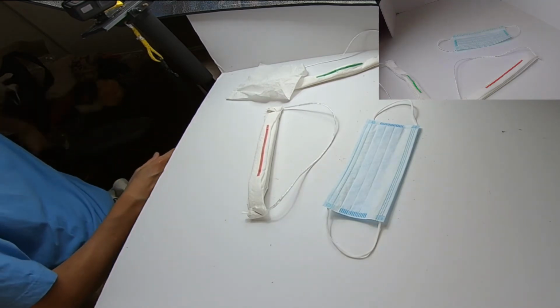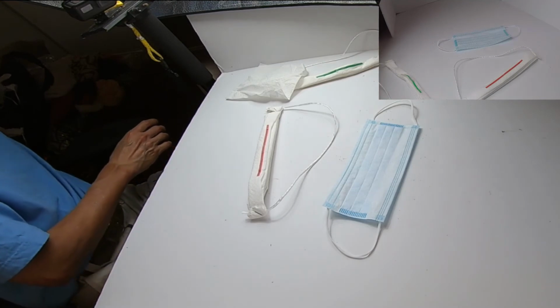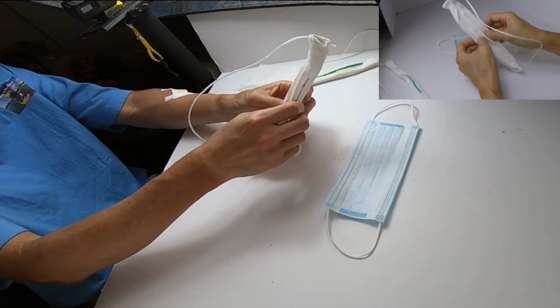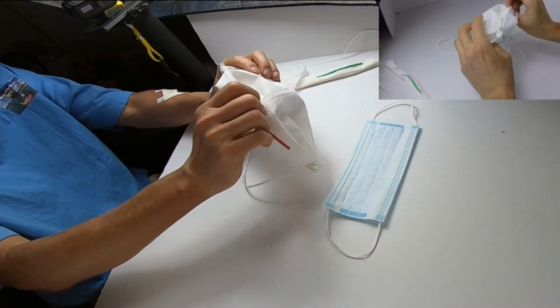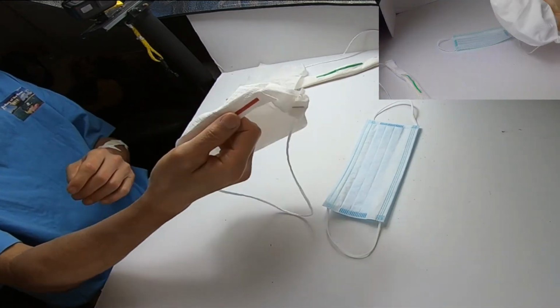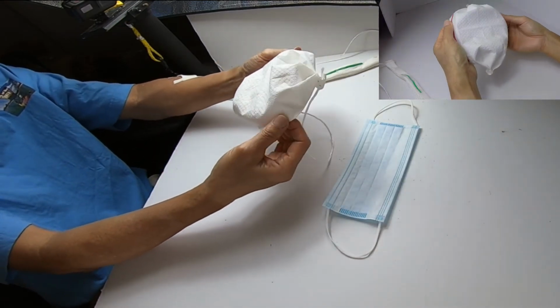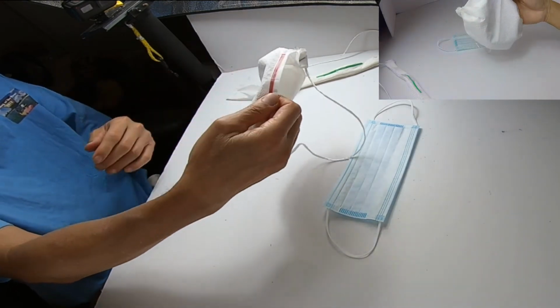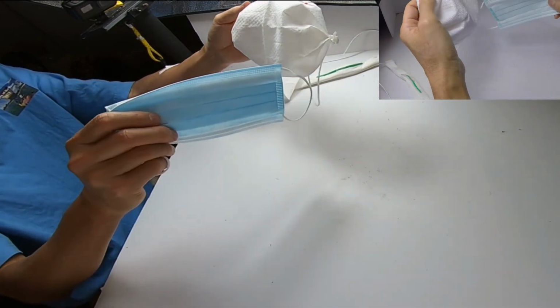So you see the finished product there, and the final step will be to open up the mask and now you have the finished mask. Now, how long did it take me to make this mask? It took me a very short period of time. And how much did it cost? Very little. And is this just as good as this?